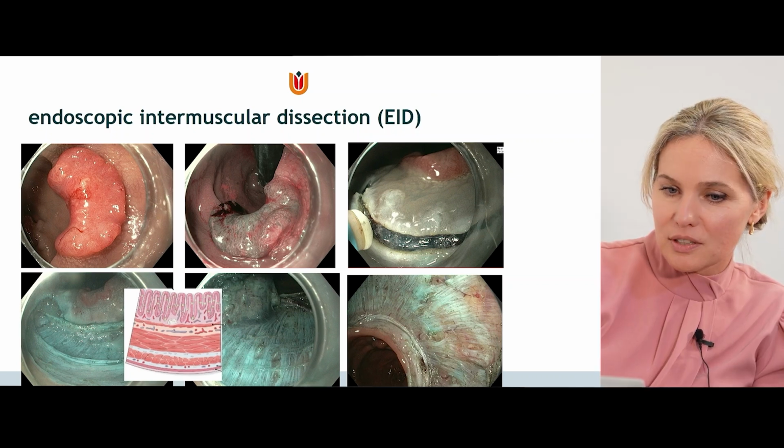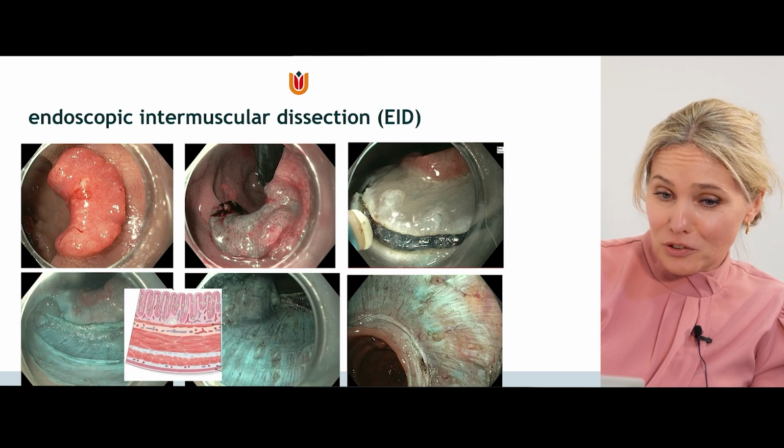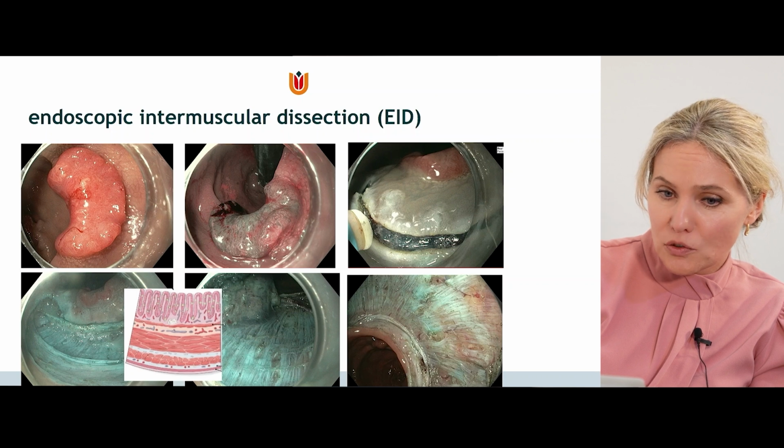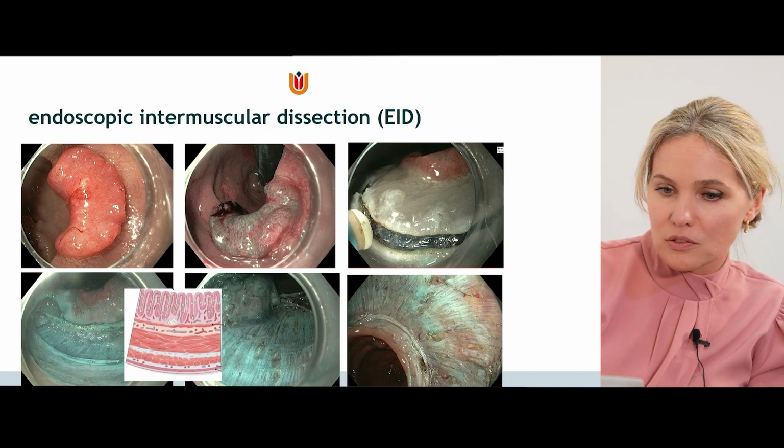Yeah. So here's the cut of the inner circular muscle. So it's a selective myotomy of the inner circular muscle, and we're exposing the outer longitudinal muscle. Yeah. You were mentioning, I think very briefly in another podcast, how the strategy is.